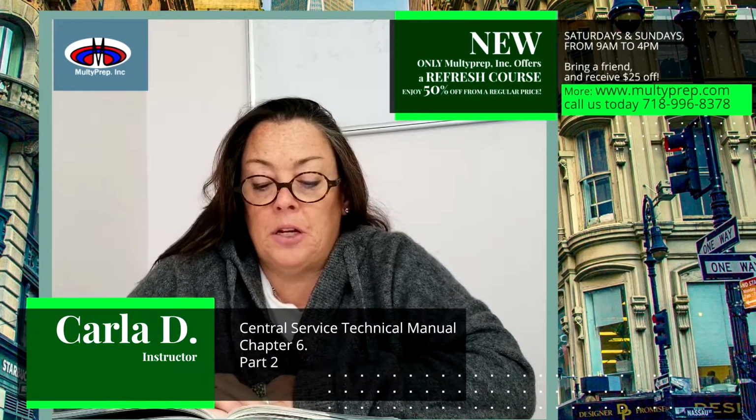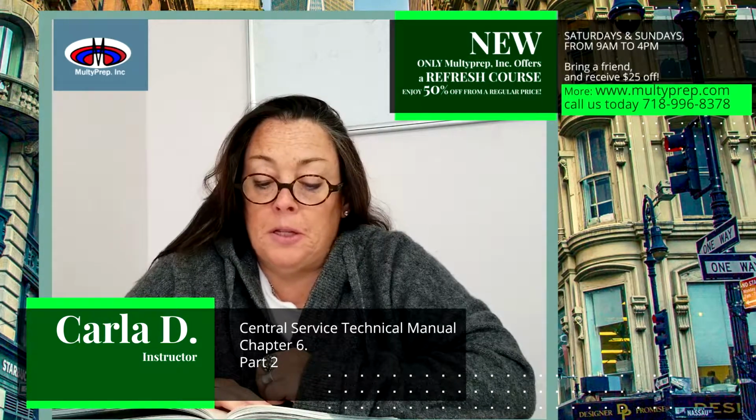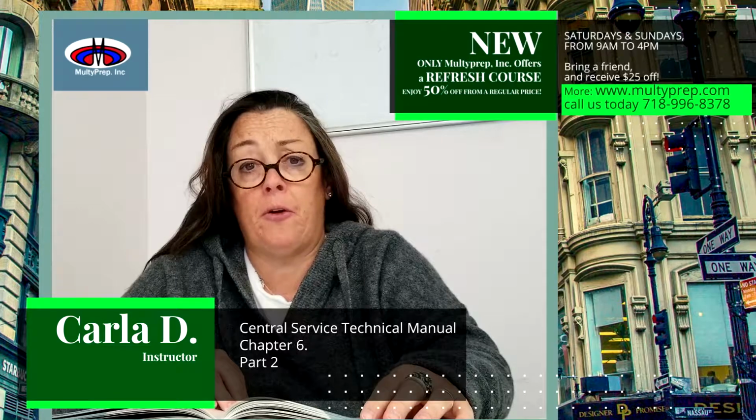To maintain the balance necessary for air pressure systems to function correctly, windows and doors between the decontamination and clean areas must remain closed when not in use. In addition to air pressure requirements, central service areas must meet specific temperature, humidity, and air exchange requirements. These vary by work area, and central sterile technicians must be familiar with the requirements for each specific area and ensure that policies designed to manage airflow, temperature, and humidity are followed at all times.